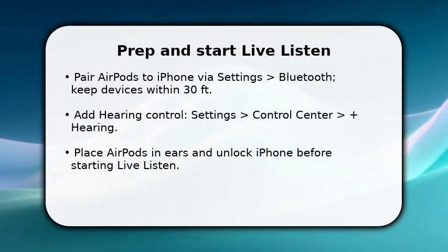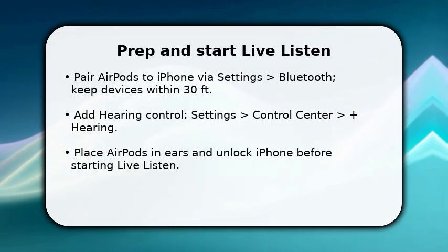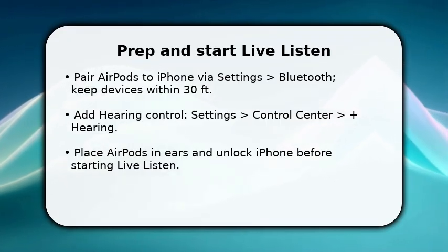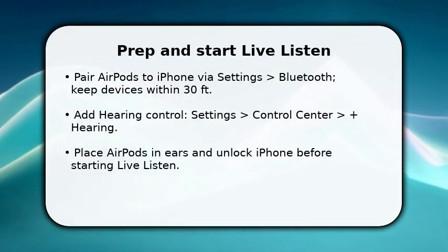You'll first confirm prerequisites. AirPods paired and added to Control Center. Once paired, place the AirPods in your ears so audio routes correctly. Next, open Control Center by swiping down or up on older models and tap the ear icon labeled Hearing. Make sure the device shows your AirPods.